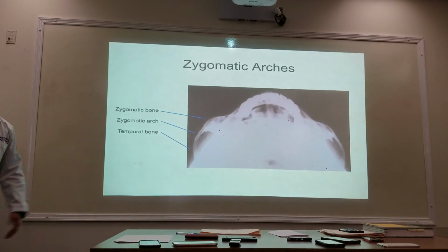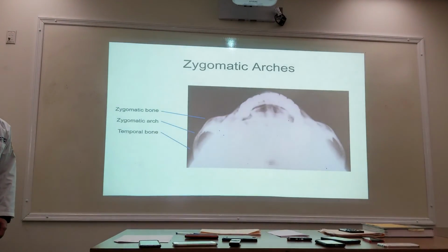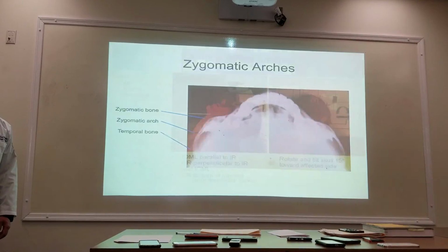I like this. This is good collimation. This one's just too much. This is good collimation. I'm all about collimation, guys.